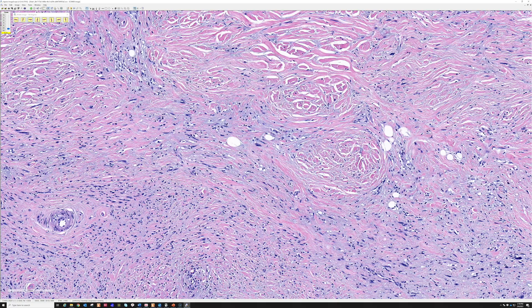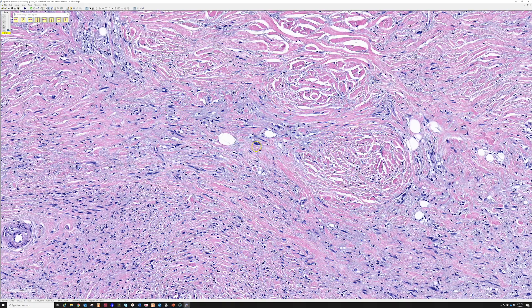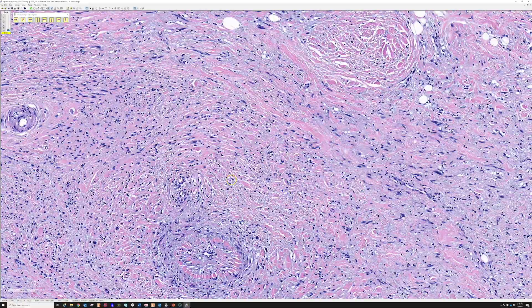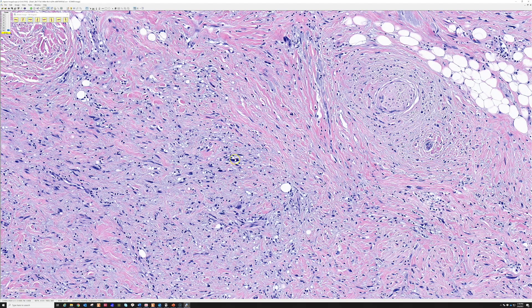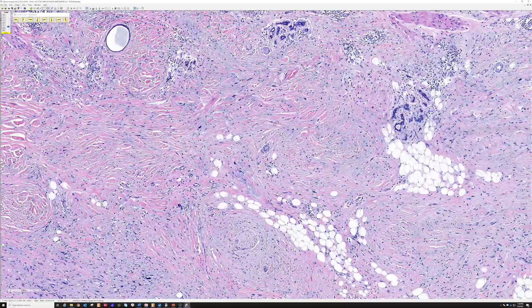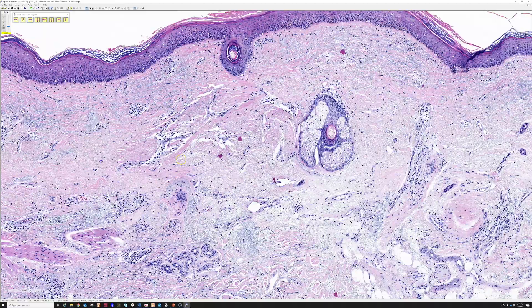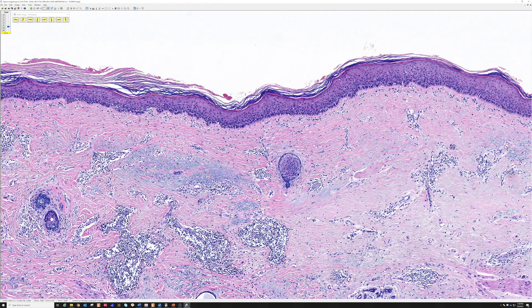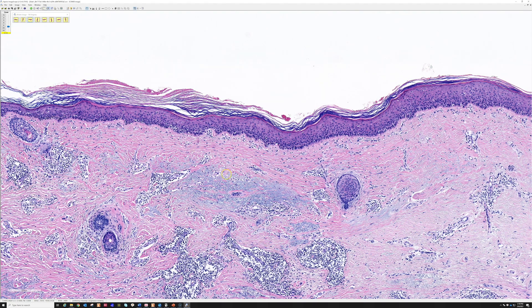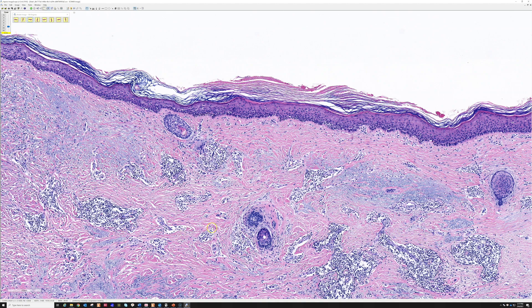Despite low cellularity, look at these scattered, very large hyperchromatic cells throughout - very large pleomorphic hyperchromatic cells scattered around. You can also identify new collagen by the fact that it is replacing the patient's solar elastosis - wiping it out. When you see collagen replacing elastosis, that means the collagen is new, being laid down after the person already became old and sun-damaged, so you have to figure out why that is happening.